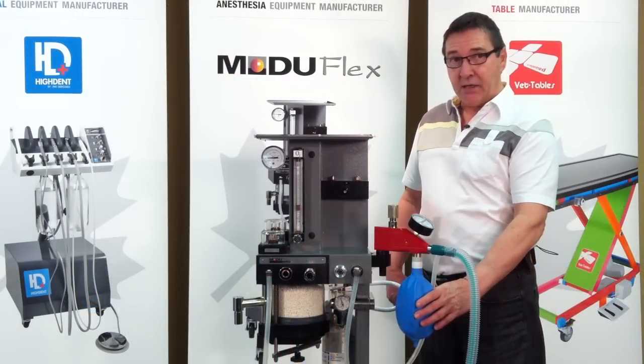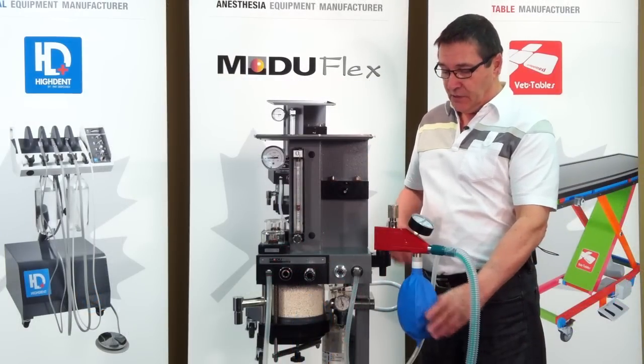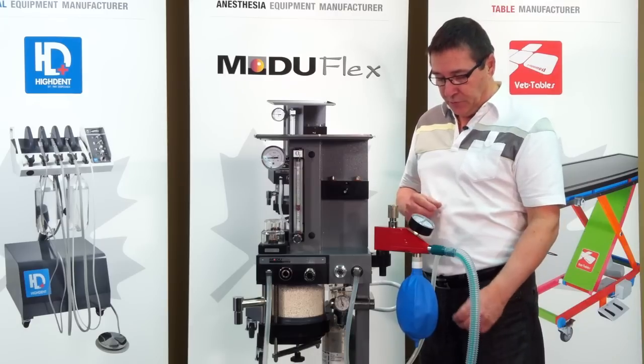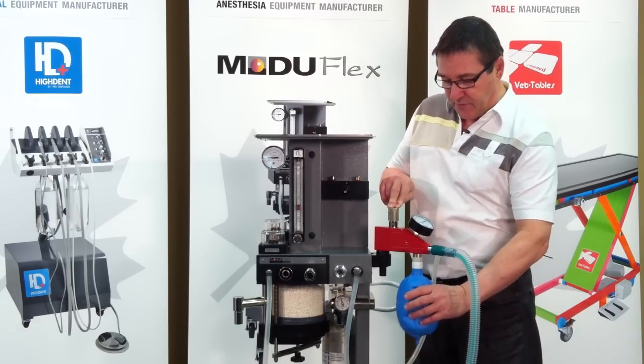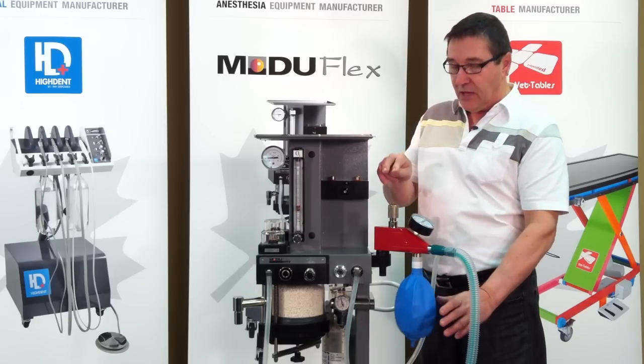Since the breathing bag is always partially inflated, we're always ready to bag our patient. All we have to do is depress the pop-off valve and squeeze the bag. Once we're finished bagging the patient, we release the valve.